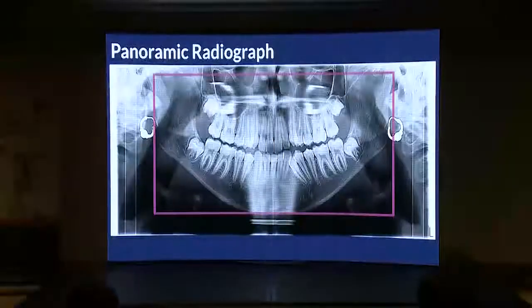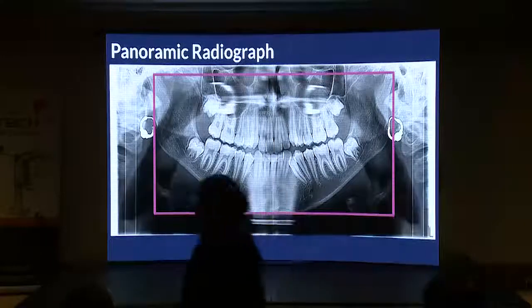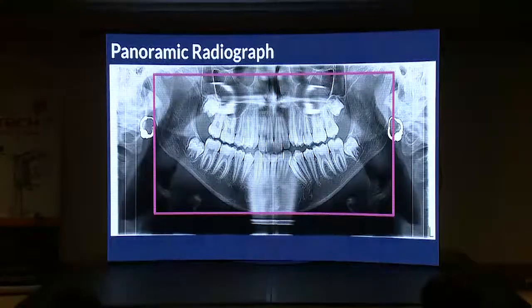For the panoramic radiograph assessment, I divide the radiograph into 4 circles to avoid missing any information. The outer circle looks at the margins of the mandible and the nasal cavity, nasal floor and the sinus. You will note that the earrings of the patient were not taken out before taking the radiograph here and in the CEPH, because they were permanently fixed in her ears, and of course it was unethical to get the patient into another radiograph to remove the earrings because they were not obstructing getting a perfect diagnosis from the X-ray. It was a grade 2 X-ray, it was fine and diagnosable.